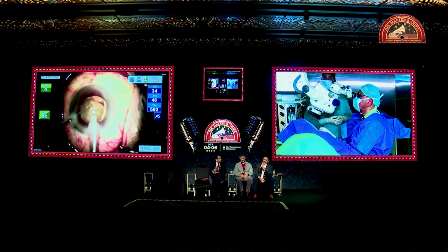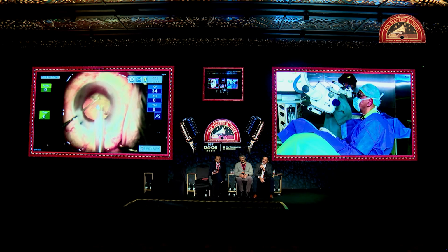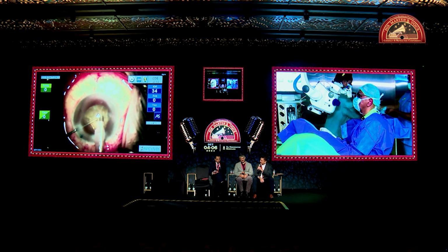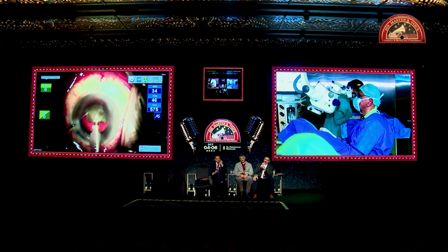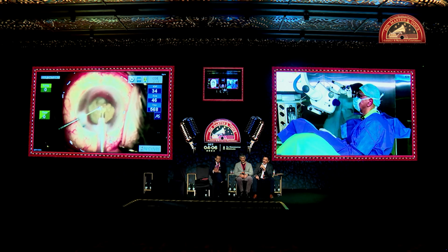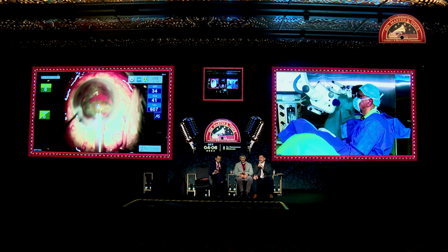The only rescue for the surgeon here is that it's always going to be a deep anterior chamber, so the cornea is far off, a couple of miles away. If it's a hypermetrope with a shallow anterior chamber, a brown-black cataract, and a dirty cornea, those cases would be bad. The only favor is that a high myope is a great advantage because you have so much place to work.